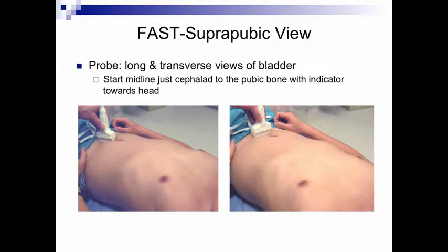And technically speaking, that's true for the superior part of the abdomen. For the superior part of the abdomen, Morrison's pouch is indeed the most dependent position, but anatomically, the most dependent position in the abdomen is actually going to be posterior to the bladder.